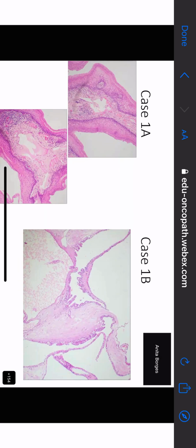Yes, ma'am. Suveta, in 1A also, I think it is an epithelial lining, ma'am. 1A also you thought was an epithelial lining. Yes, ma'am. Suveta, if you thought that 1A was an epithelial lining, then why did you say that that was not a secretion? If you have an epithelial lining and you have something inside of it which is pale or moderately pink, why did you say it was not a secretion then?